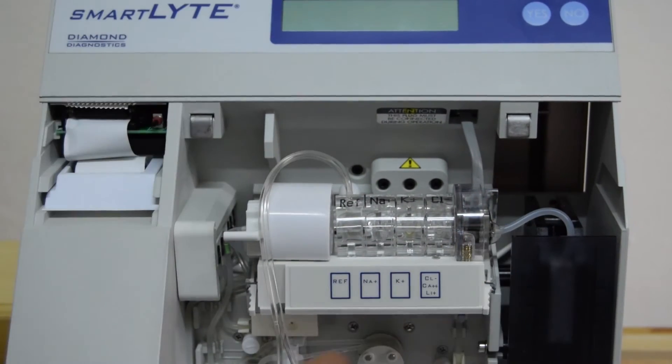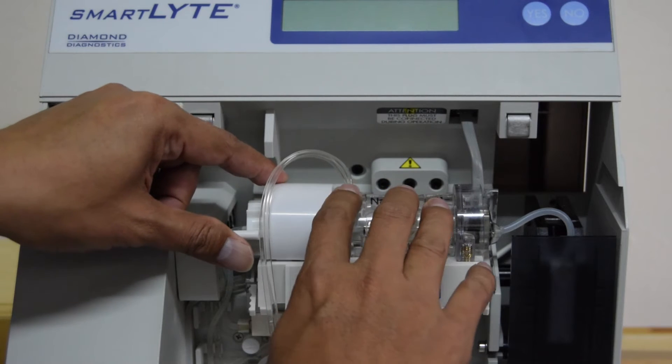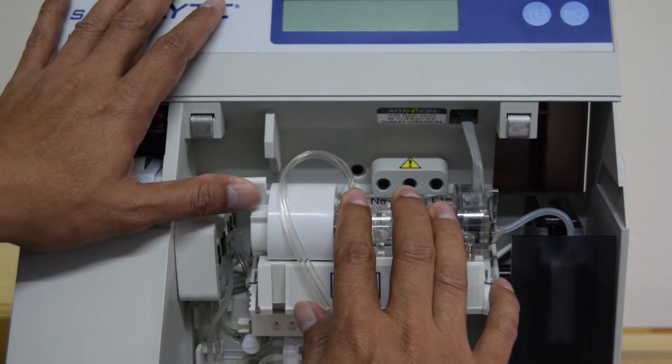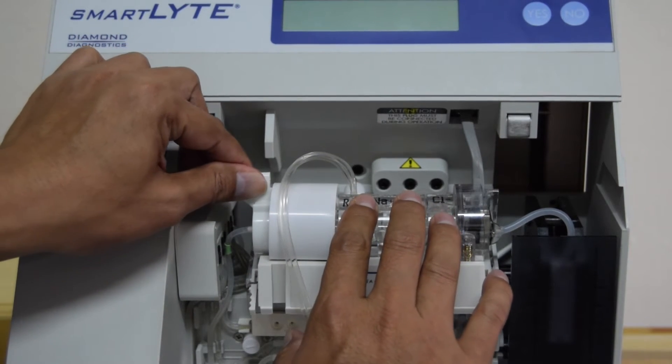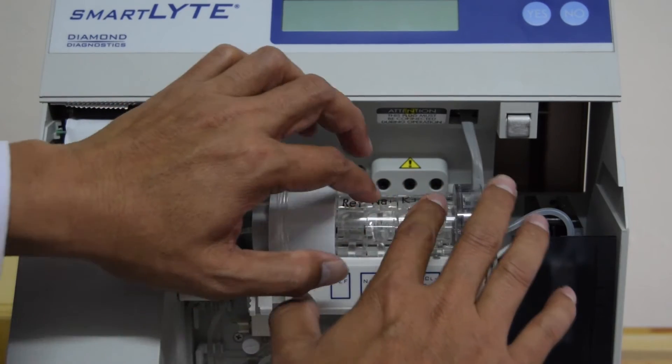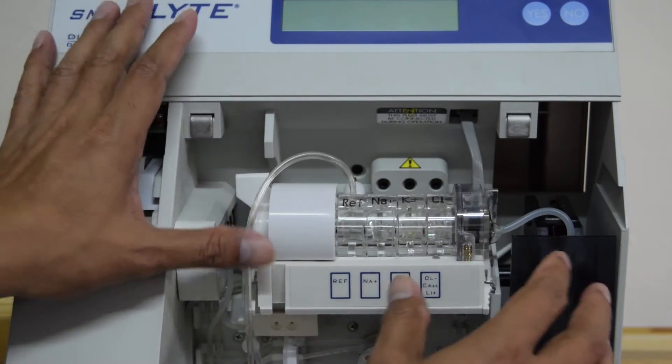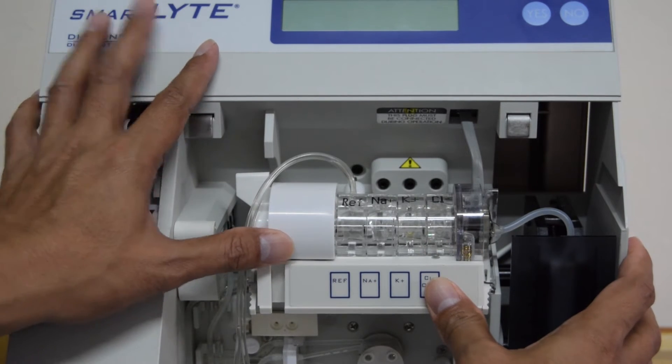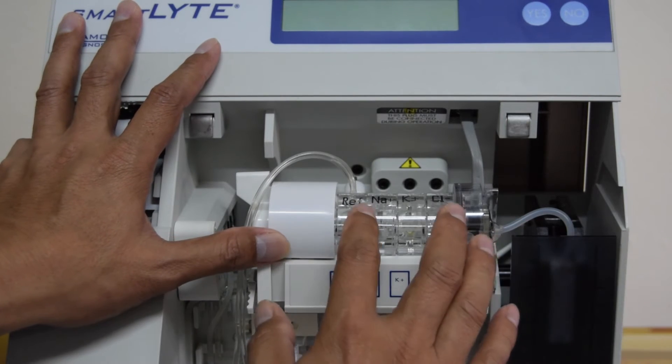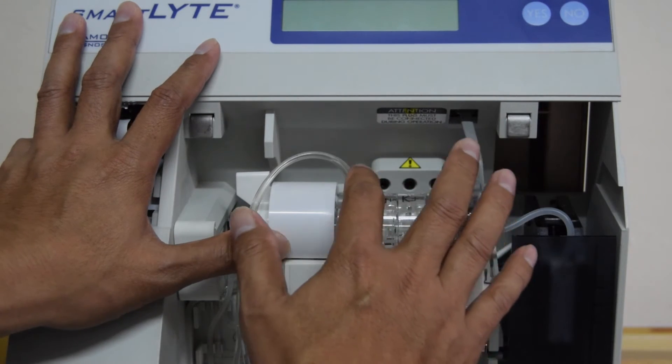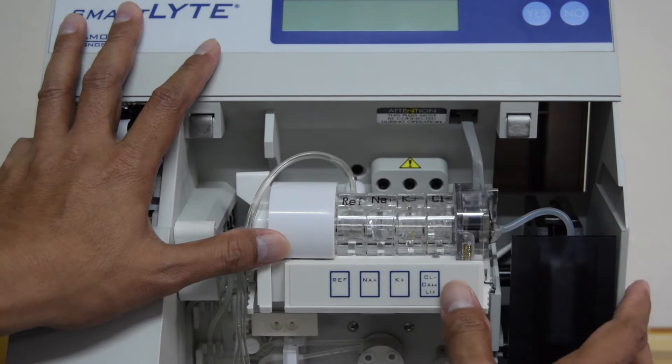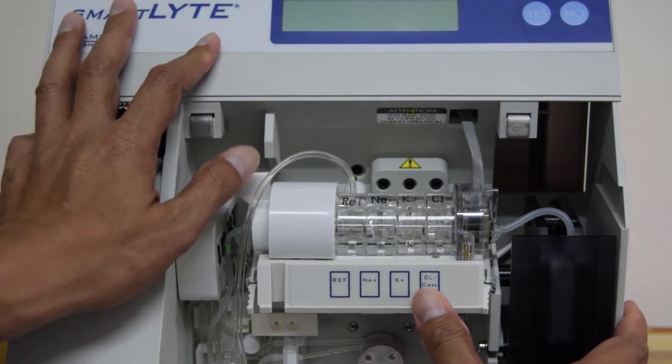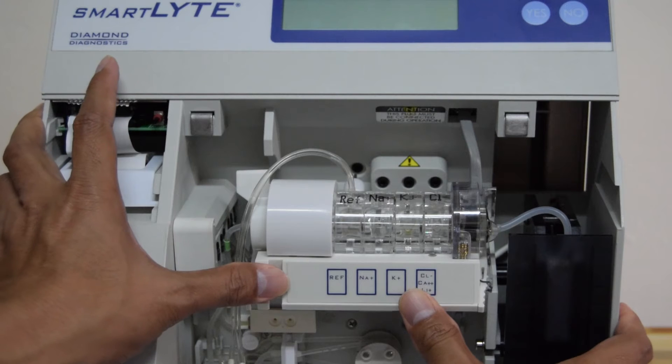Setelah semua terpasang, keempatnya. Perlahan-lahan kita tutup tuas yang sebelah kiri. Tutupkan perlahan. Sambil melihat ke depan ke alat elektroda. Dimana ada sensor elektroda yang ada pada tiap elektroda ini harus tepat masuk pada lubang yang sudah ada di dalam. Jadi, kita tidak perlu merapatkan sekaligus. Kita pelan-pelan saja. Setengah. Terus kita majuin pelan-pelan.